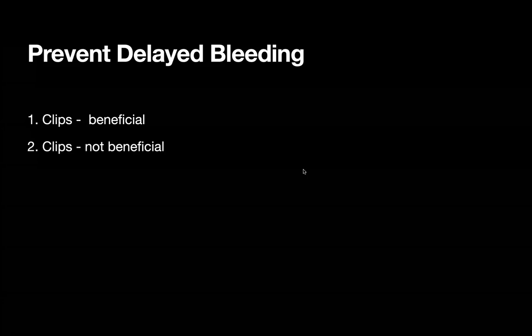Sylvia, what do you do? Yes, sir. Yes, I agree. I agree with Sylvia and Roy. It's a large lesion on the right side. I would close it. Okay.